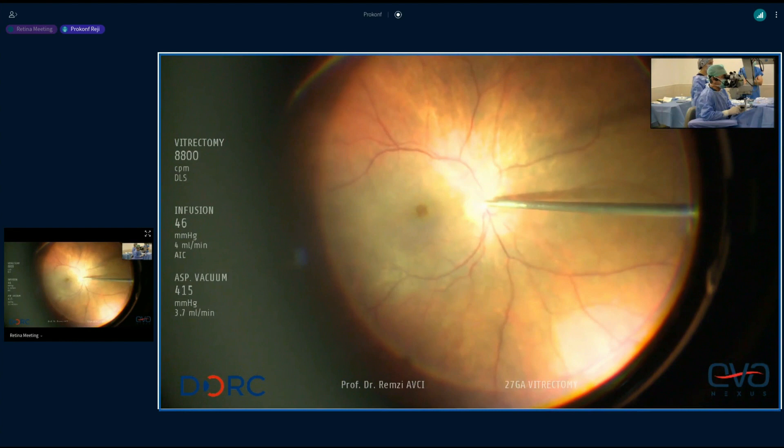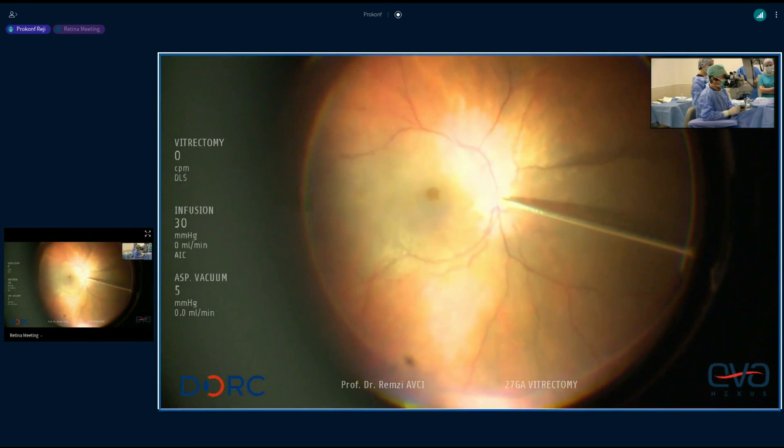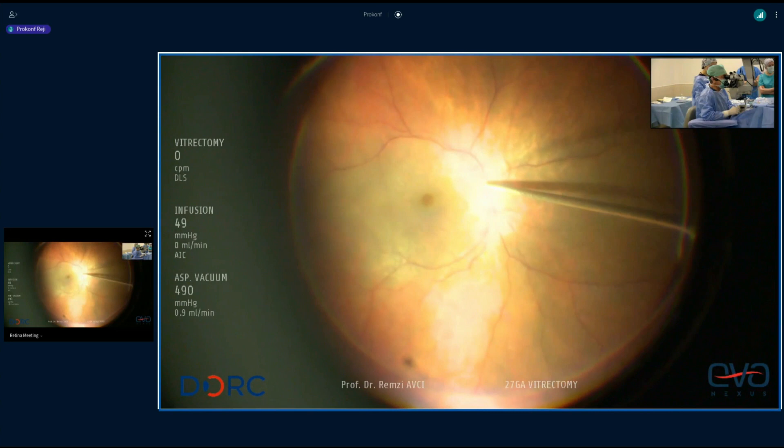Remzi, which system are you using to do the surgery with? The system is DORC EVA Nexus 27 gauge VETA trocar. The microscope is Müller-Wedell HR 900 and IBOS system for viewing — IBOS 2.